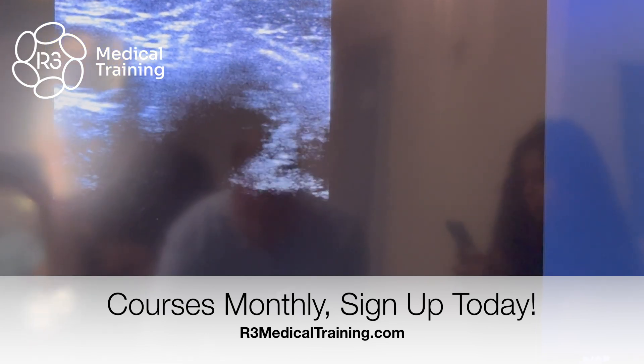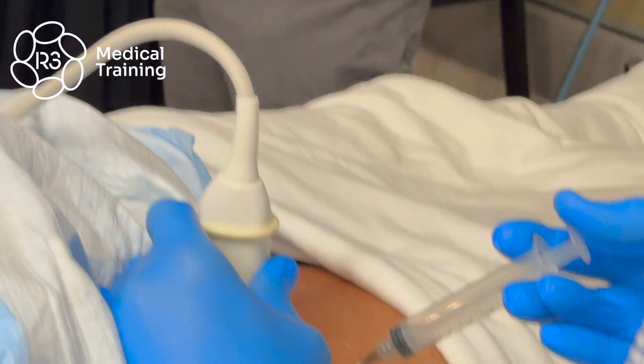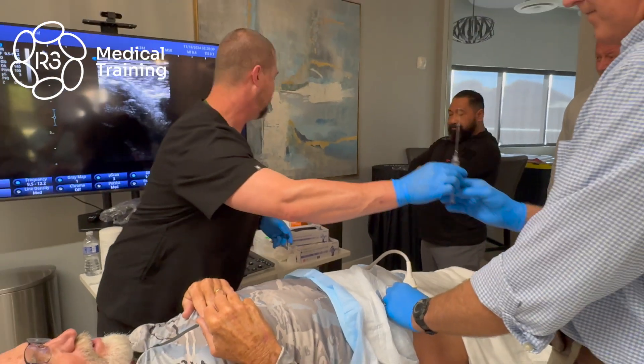Now this is the reason why we don't go blinded — does everybody know what that is? It's a pulsing — that's the femoral artery. And we know the femoral nerve is right next to it — right there. There we go. Nice job.